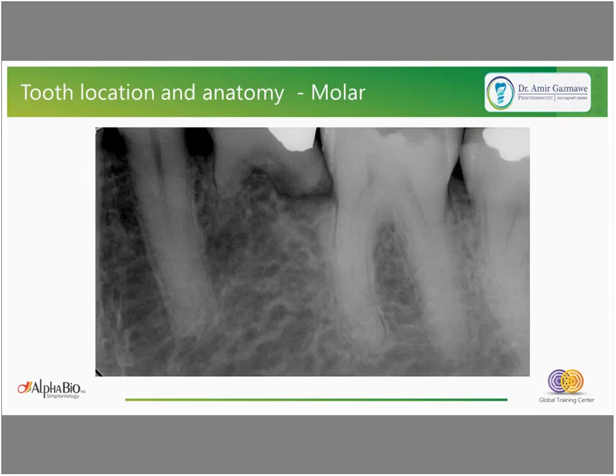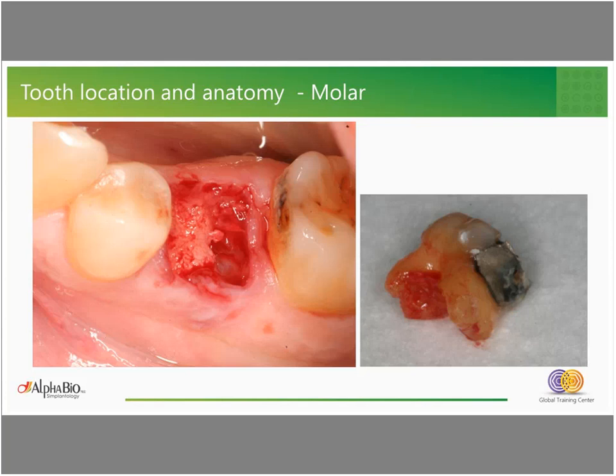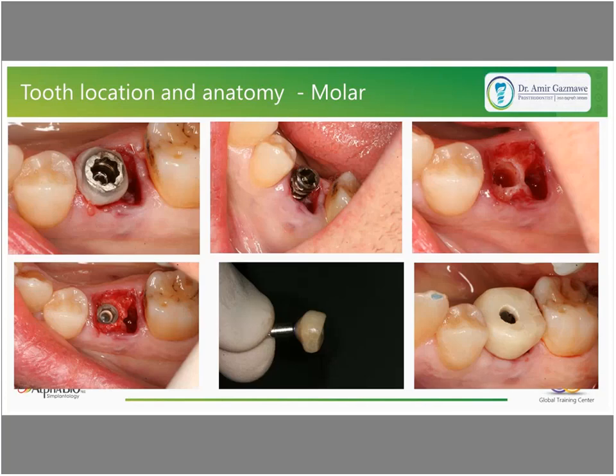The next case is actually deciduous tooth that we're missing, and we are supposed to replace this tooth because of mobility. So we try to make the restoration immediately at the day of implantation. This is the impacted submerged tooth extraction. We have to equalize the height of the bone, and we can make the implantation at the same day for extraction, because actually we don't have that much of socket, because we have very short roots.